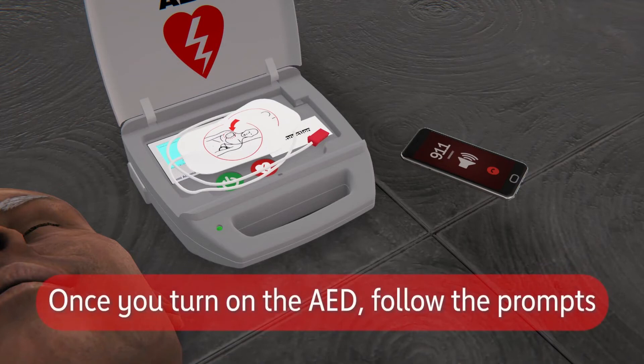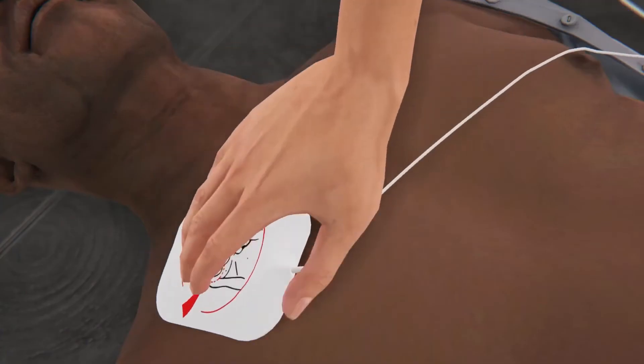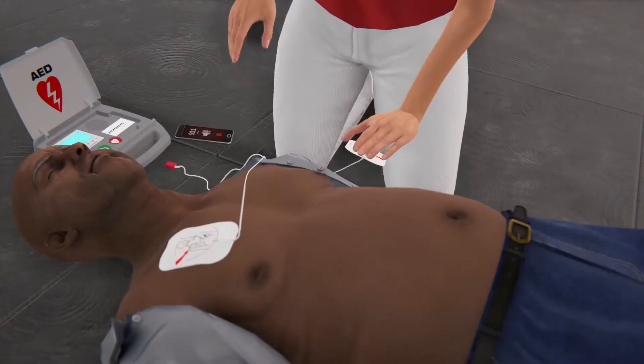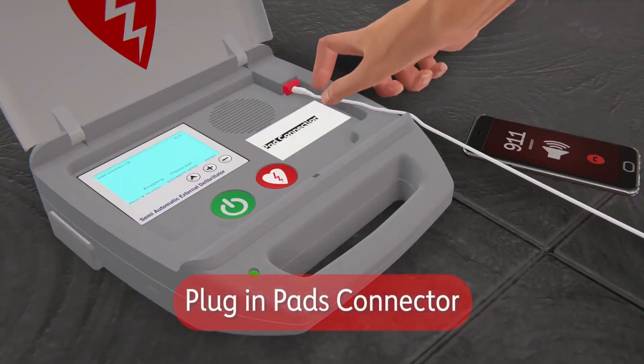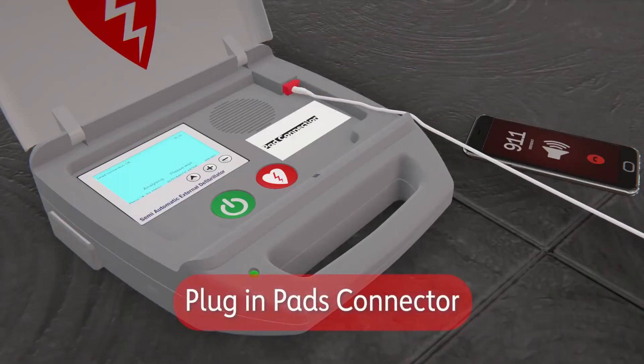Turn the AED on and follow the prompts, which will tell you everything you need to do. Peel away the backing from the pads. Ensure there is nothing between the pad and the person's bare skin, then plug in the pads connector into the AED if necessary.